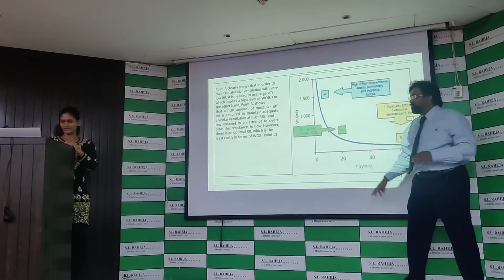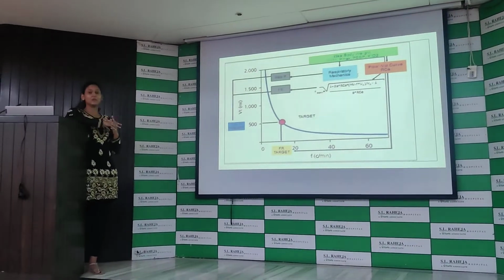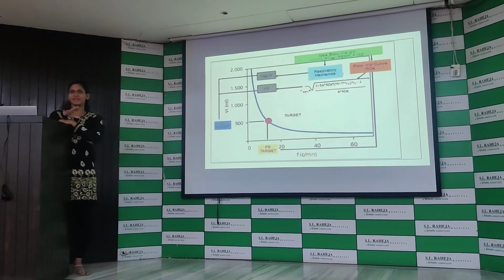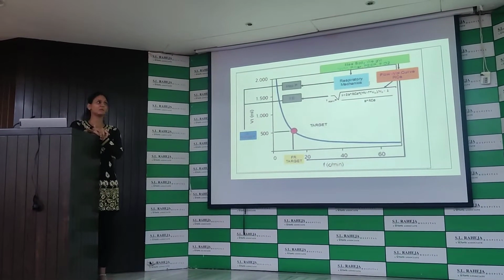How do I get it here? Okay, once we put our ideal body weight in the ventilator, there are certain settings which we set in an ASV mode, which is the percentage of the minute ventilation, the peak, the FiO2.